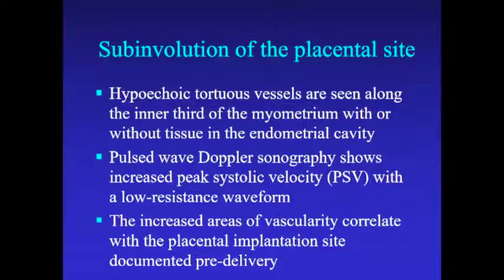Subinvolution of the placental site: the placenta needs to invade the myometrium — that's how it gets vascularity to the fetus and delivers oxygen and nutrients. You see hypoechoic tortuous vessels along the inner third of the myometrium without any tissue in the endometrial cavity. A lot of people end up calling this an AVM because they don't see a mass. But AVM should be thought of as something congenital. This is physiologic but persistent, so we need another term. Pulsed wave Doppler shows increased peak systolic velocity with a low-resistance waveform, and the vascularity correlates with placental implantation site documented pre-delivery.